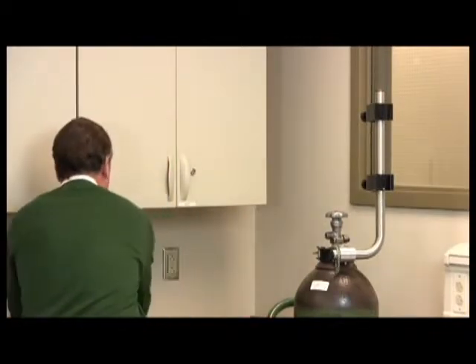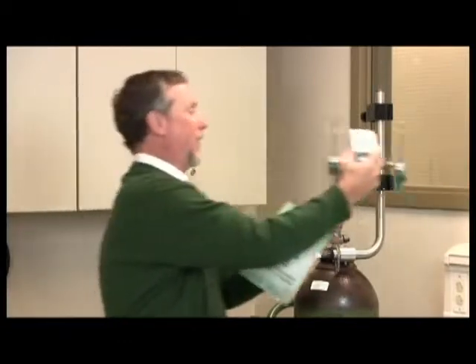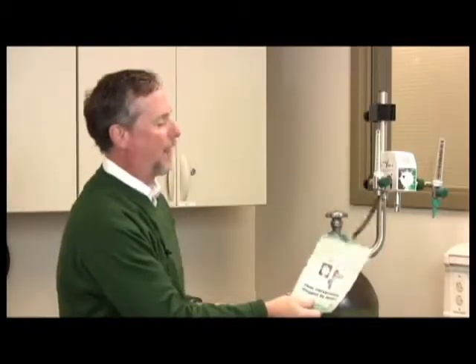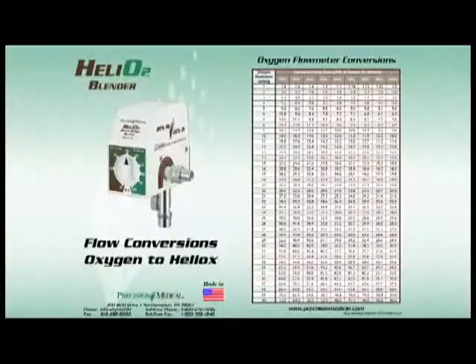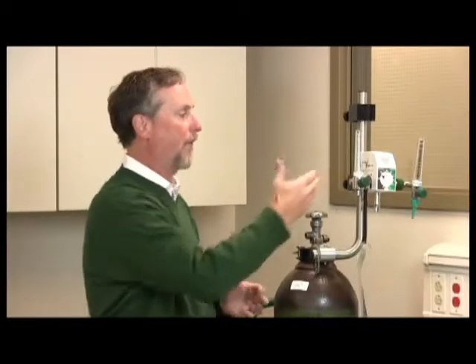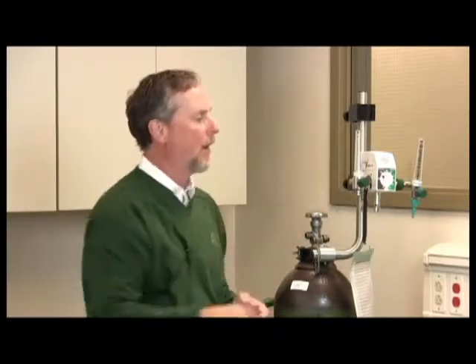So from there, what we can pretty much do is hang our Heliox blender from here. This goes on to the lower pole clamp. And with our blender, we have our oxygen flow meter conversion card that we can talk about a little bit later, but I always affix that to one of the flow meters. And it really doesn't matter what flow meters we put on here. These happen to be 2 0 to 15 liter flow meters.